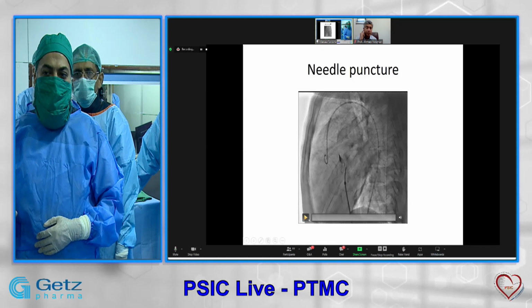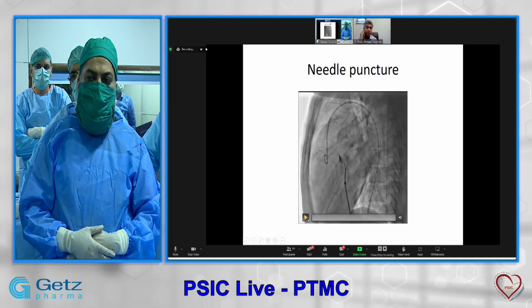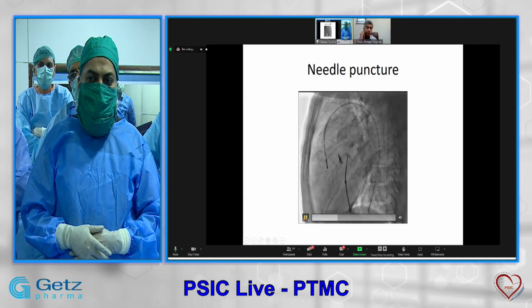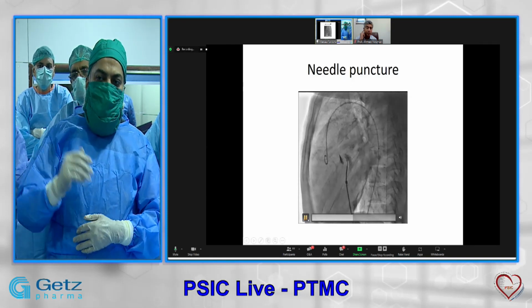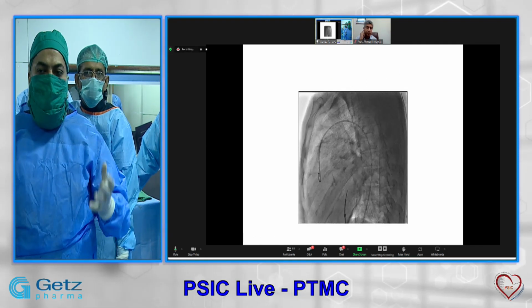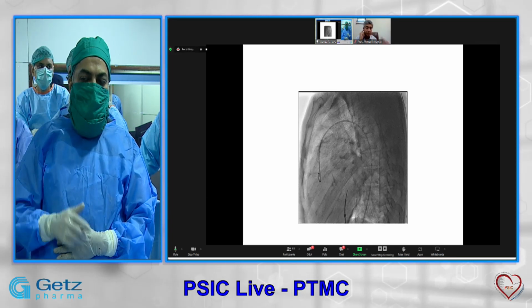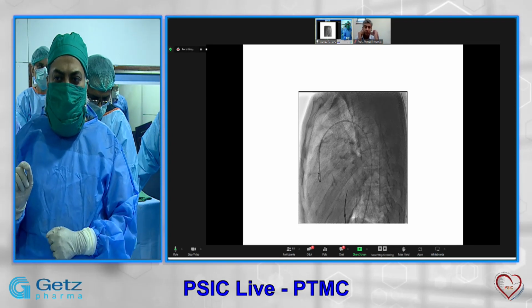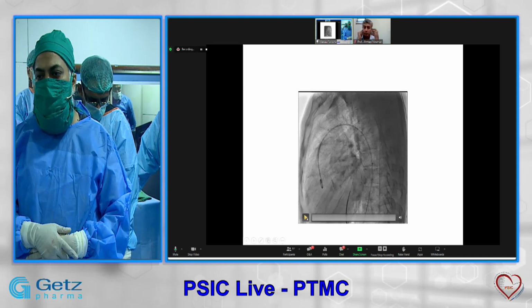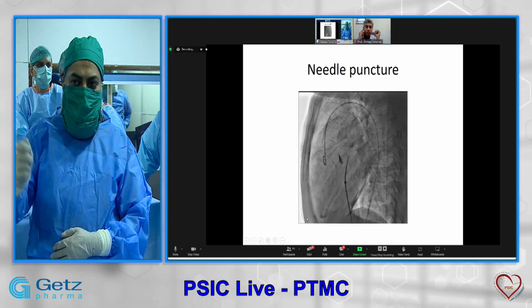This is an important thing you need to understand. Sometimes, once you have punctured and you give the dye, these few slides will tell us the importance of giving dye and taking this angiographic or cine image. Once you give this dye, you see something weird. You don't see the dye flushing and washing away. You see the dye is staining there. So this was a needle puncture. If you have punctured the LA just with your needle and you have not introduced anything further, go one slide back. The dye will stain into the pericardium. You can still bring it down.